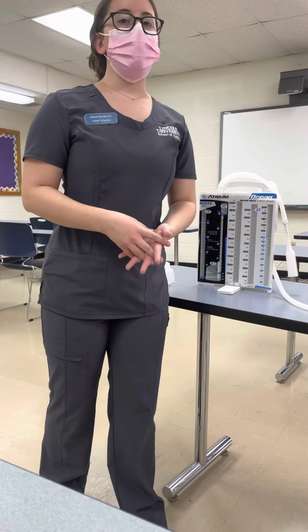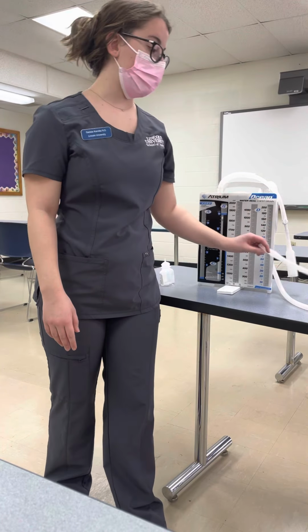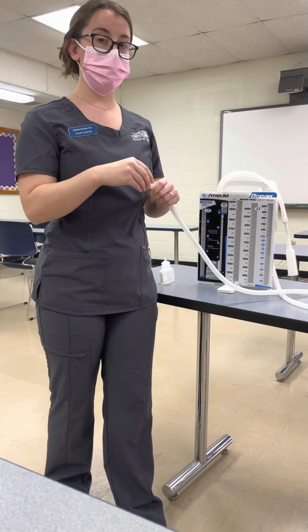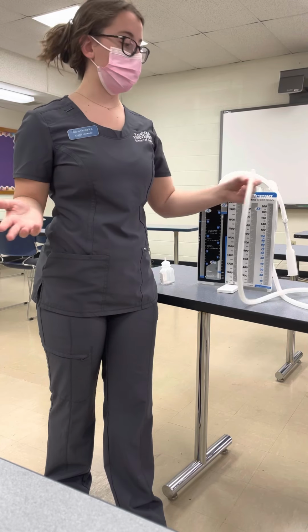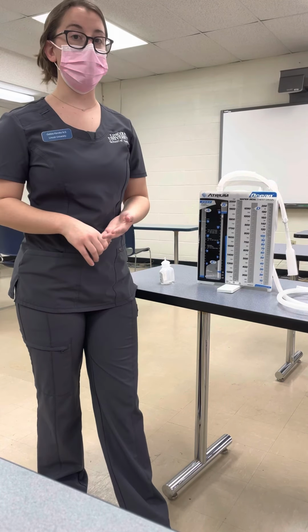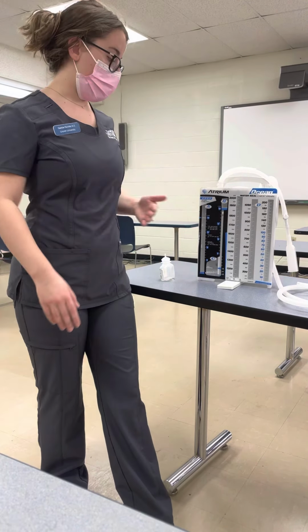What we can do for that is we can first just check the dressing sites and the tube connecting Y connectors. We want to make sure that if there is reason for the air to get escaped into the tubing or around the dressing, we can just address that, maybe apply a new dressing to it. If we see that the connectors and the dressing are placed properly, then we want to make sure and notify the provider because that could be an air leak in their lungs.